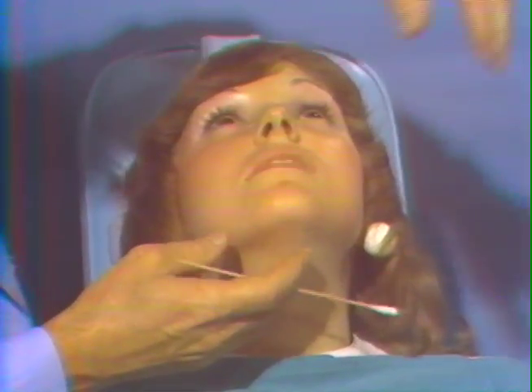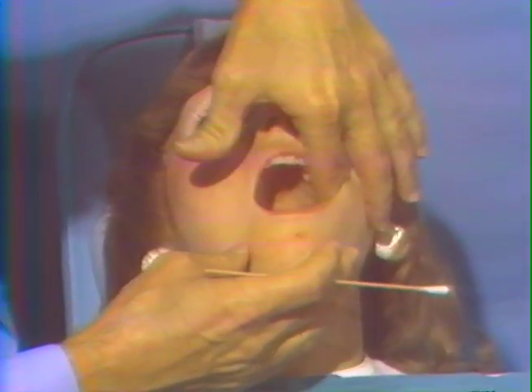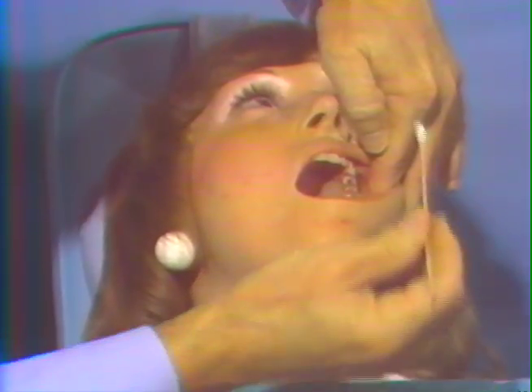Betty, tip your head back just a little bit for me and open real wide. Let me retract your cheek a little bit. Turn your head a little to the left. That's it, like that. Hold real wide. Place the cotton tip applicator in this instance in the area of the greater palatine foramen on this side and hold in place, retracting with your finger or retracting with the cotton tip applicator.